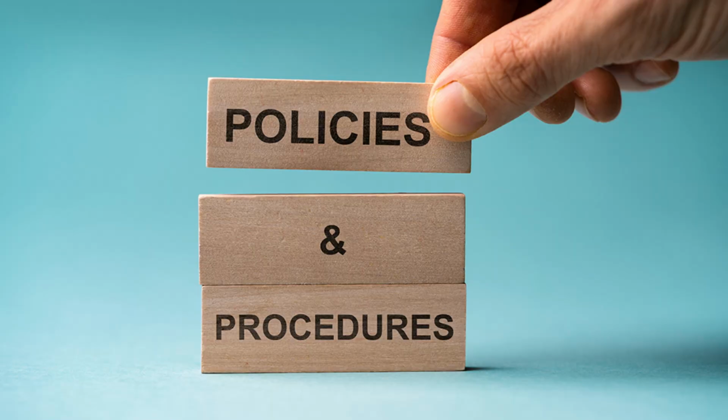And make sure that you know what type of battery is in your wheelchair. The only one that we know of that is allowed to fly under cargo is what is called a gel battery. If your wheelchair does not have that, it will not be permitted to fly. The second thing you need to know is to take pictures of your chair from all different angles. If something does happen and it is damaged, you want to have those pictures, whether it's on a phone or in your bag somewhere, as proof that your chair was damaged, and look into the airline policies to see what they do in that situation.